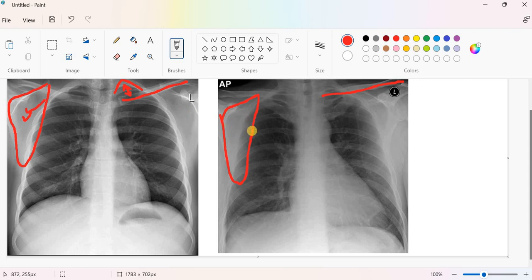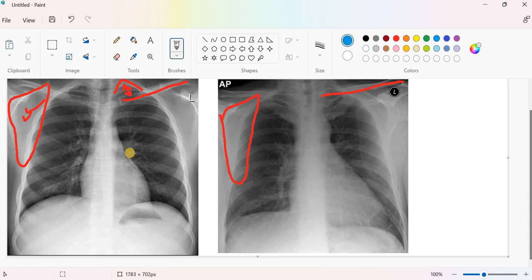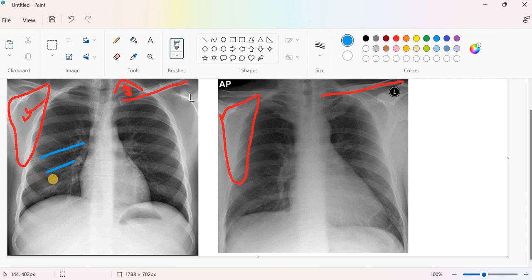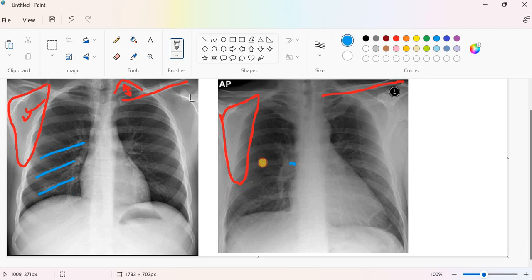The third point is the ribs, how they are looking like in the chest X-ray view. In the posterior anterior chest X-ray view, the ribs always mostly appearing as oblique or diagonal, the posterior end of the ribs. While in the anteroposterior view, they are appearing more or less horizontal.